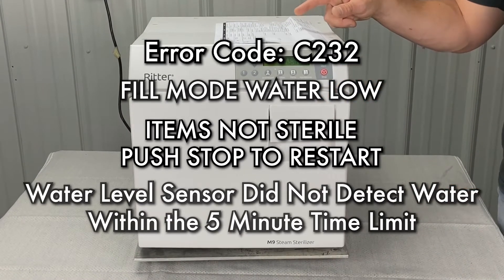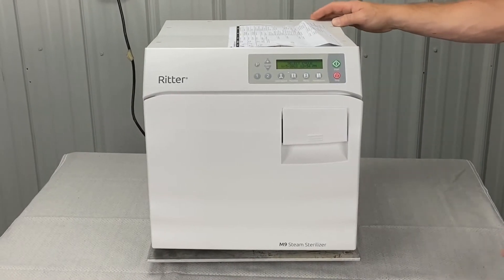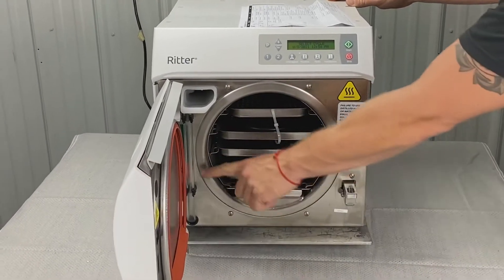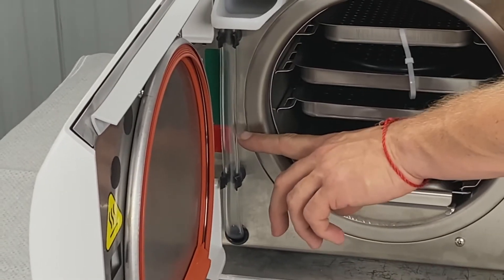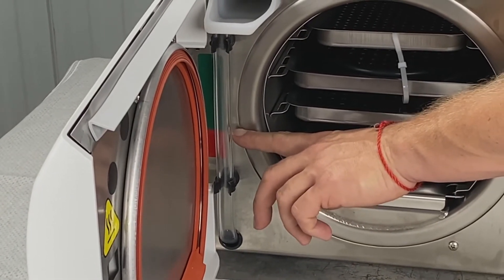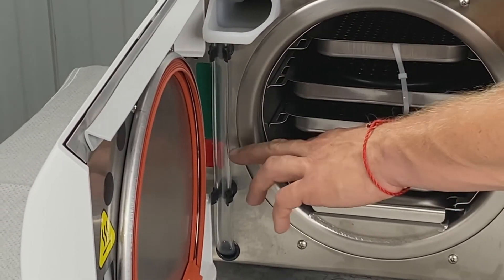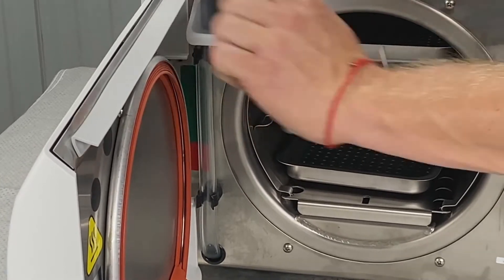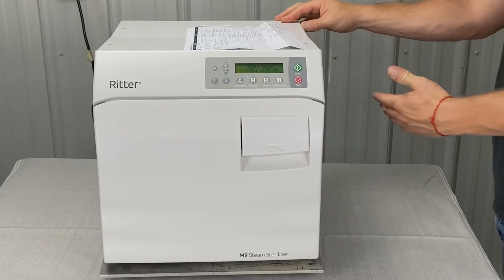The water level sensor did not detect water within the five-minute time limit. A couple of obvious things: the reservoir water level is low. If your water is in the red, it might not fill — especially if you're doing back-to-back cycles, it probably will not fill at all. Add water up to the line and start another cycle to see if the problem persists.